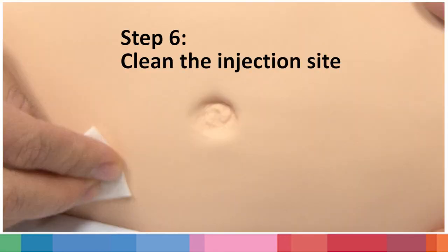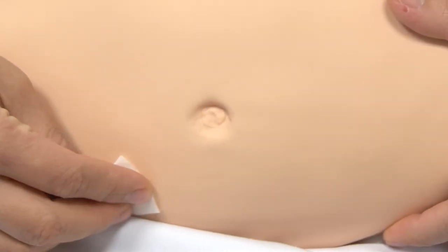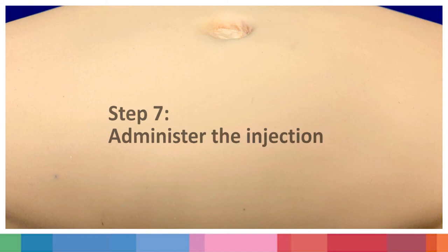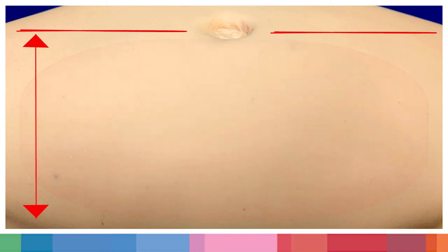Step 6: Clean the injection site. Clean the selected site with an alcohol swab and let it dry thoroughly before the injection. Step 7: Administer the injection. The injection can be given anywhere two fingers below the navel.